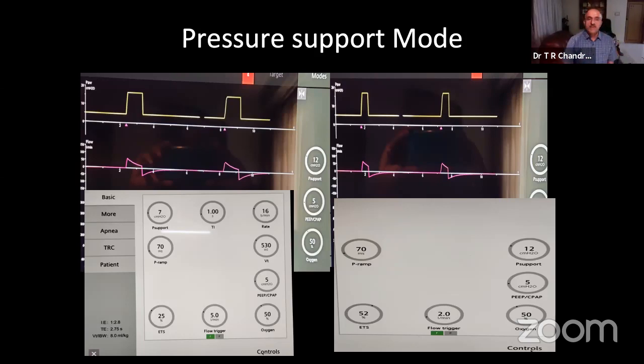And don't forget, the trigger is wrong here. Trigger, remember 1 to 2. Any more questions? Sir, I think many people practice that if the patient is on pressure support mode and tachypneic, they try to increase the flow trigger and kill the breathing efforts. Actually, we are doing more damage.